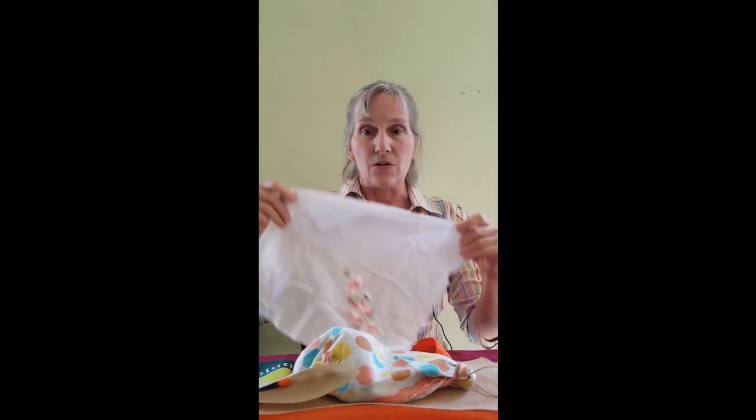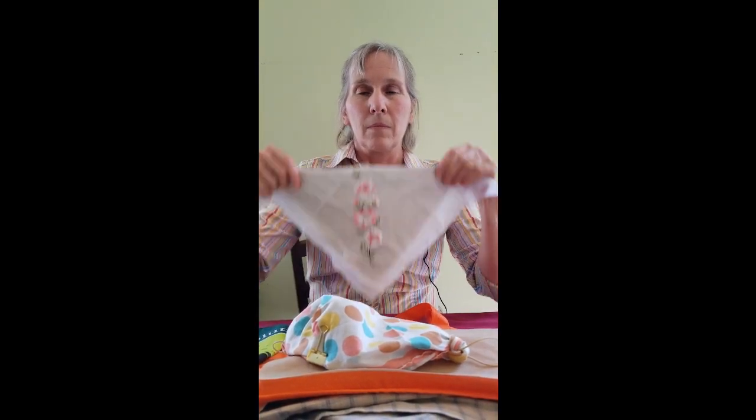Take your handkerchief, or whatever you're using as your 10-inch square, put that polypropylene layer, double layer, in the middle. You're going to get this fastened around your ears. We're going to snug this up, and you're going to wind up with kind of a form-fitting mask like this.